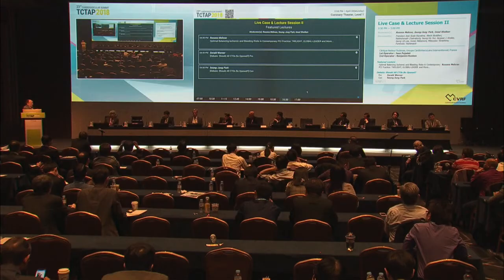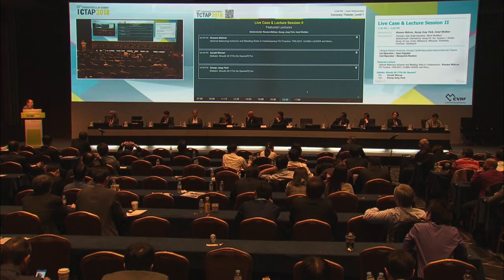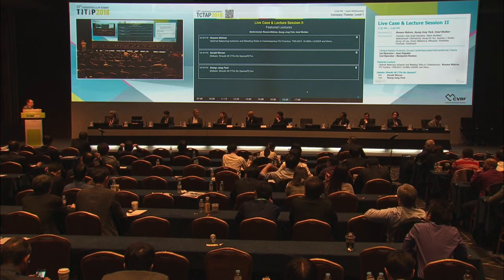So the question is, why did the patient receive an angio? He mustn't have been completely symptomless, because otherwise I don't do angios in 43-year-old patients. I see a lot of CTO patients, and they are so-called asymptomatic. But they adapt because it's a stable situation, and they don't exercise as much as they would do, but their quality of life will be improved when we open viable myocardium.